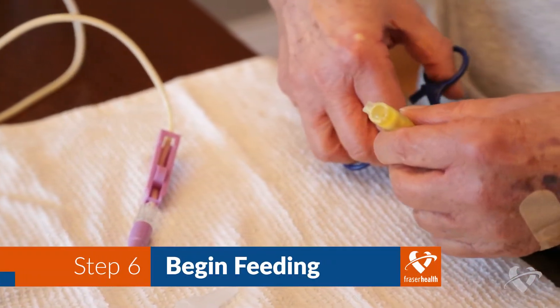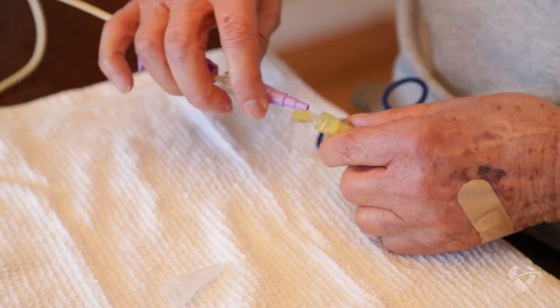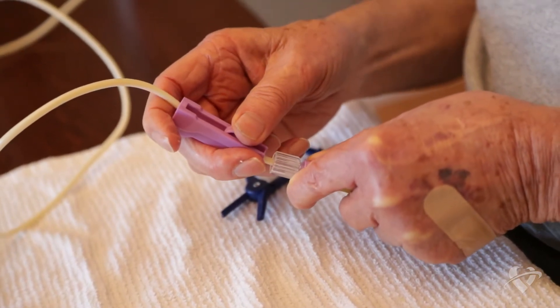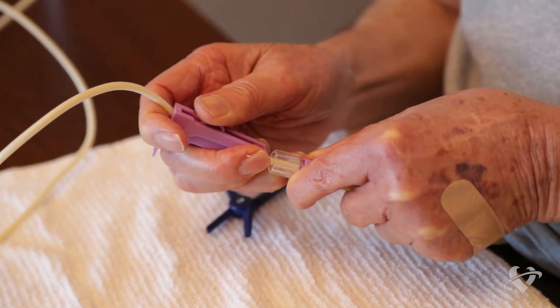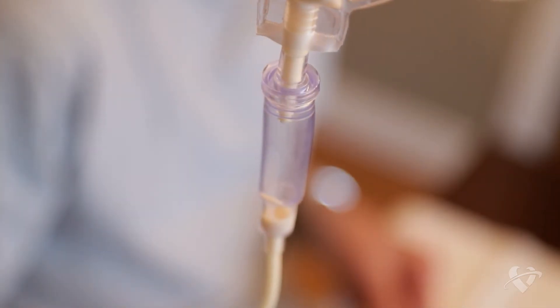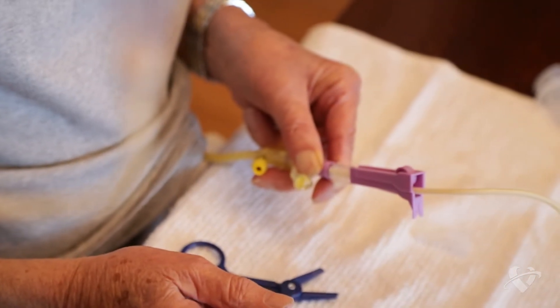Clamp or pinch your g-tube before you remove the cap of your feeding port. Connect the primed feeding bag tube. Unclamp or unpinch the g-tube. Slowly open the roller clamp to begin feeding. As you adjust the roller clamp, count the number of drips in the drip chamber over 30 seconds. Your dietitian will give you instructions to help you determine which rate or speed is best for you.